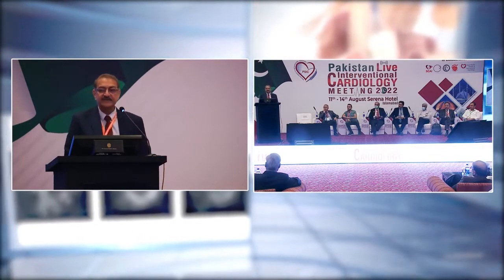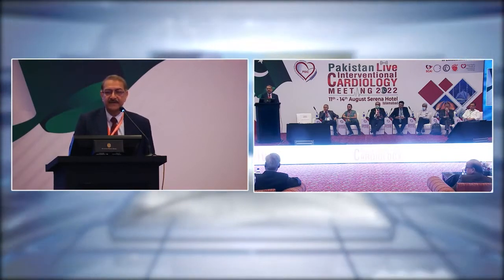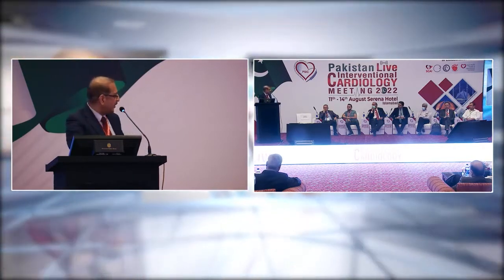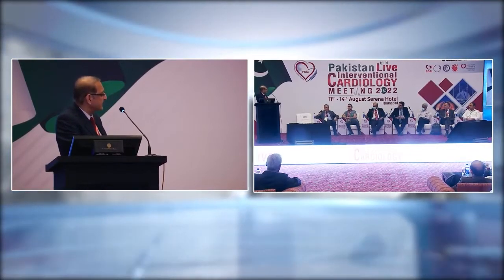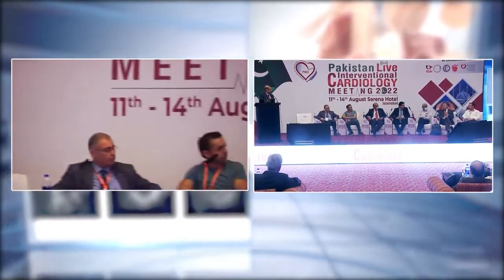If there are any questions from the audience regarding CTO technique? I think, how many of you are doing more of CTOs? Professor Chen, in your lab, do you do more retrograde or antigrade? What is the incidence? I think this is a very challenging question. There are still two parties, antigrade and retrograde, so the selection of approach depends on the anatomy. Usually from my hand, 85% is antigrade, only 15 to 20% by retrograde approach.